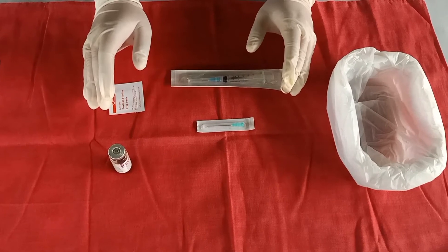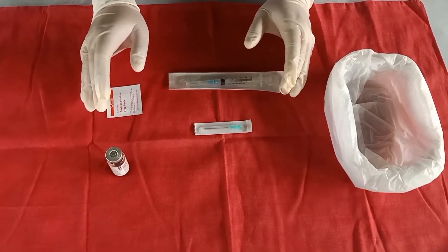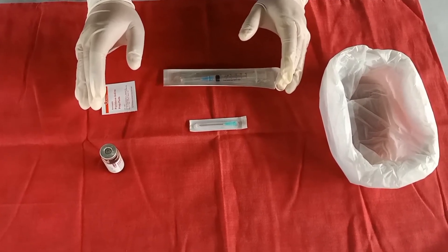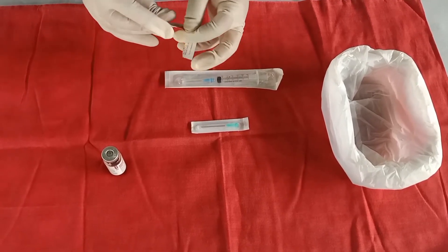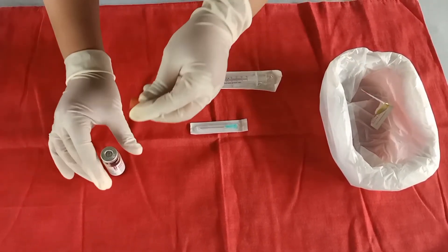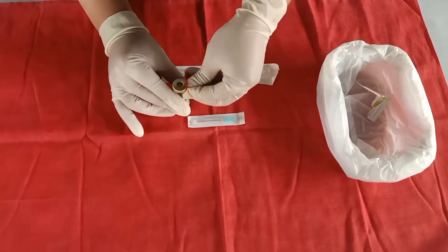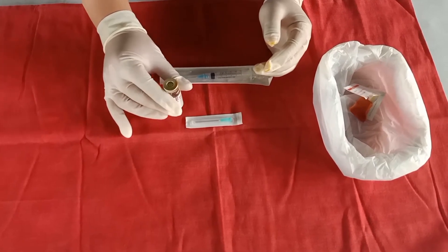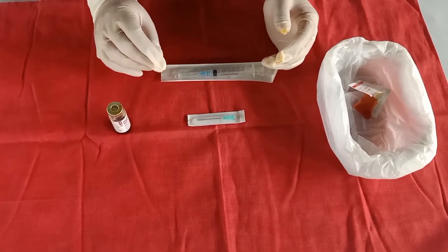Remove the protective cap or clean the rubber cap of a previously opened medication vial with an antiseptic wipe by rubbing in a circular motion. Attach a withdrawing needle to the syringe and ensure that it is firmly attached to the syringe.